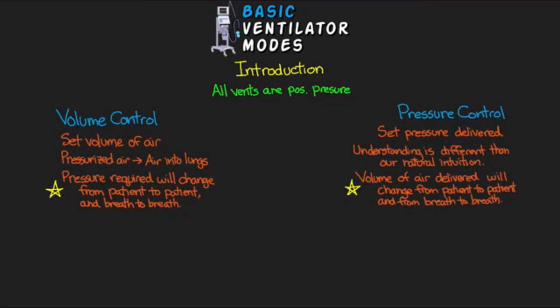Now, within each of these main categories, there really are many different modes, and even some that cross in between both of these categories. But for the purpose of this lesson, we're going to be sticking to just talking about volume control. Like I said, the main principle for volume control is that we want to ensure that our patients are receiving a set volume of breath each minute.